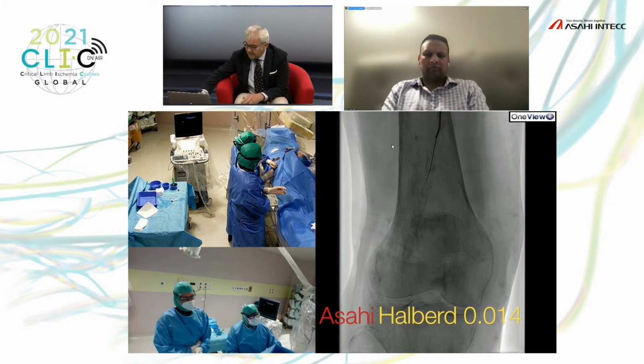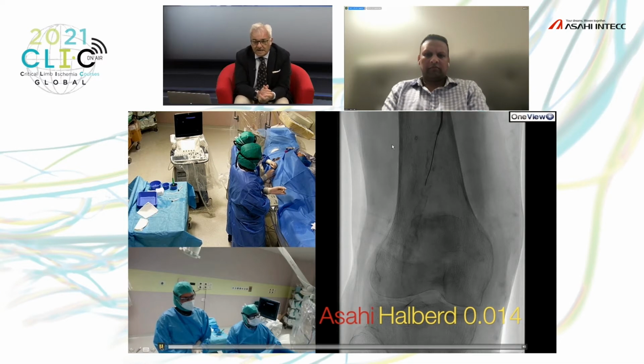But we have to follow the behavior of this wire.